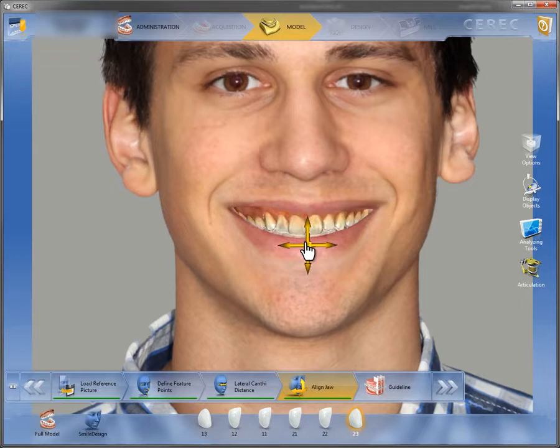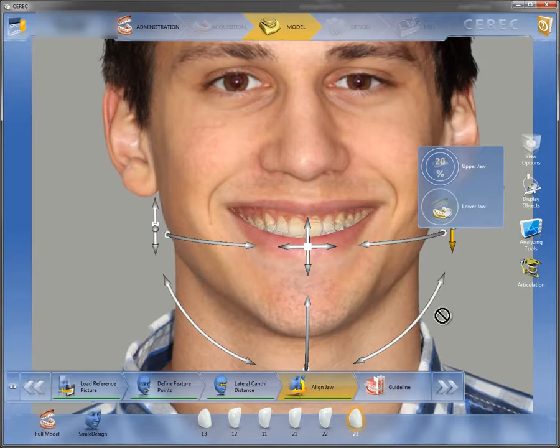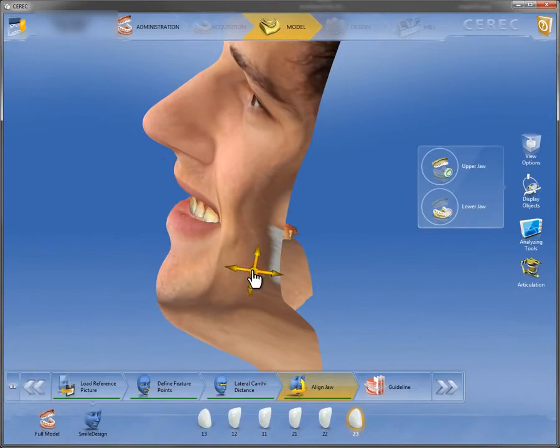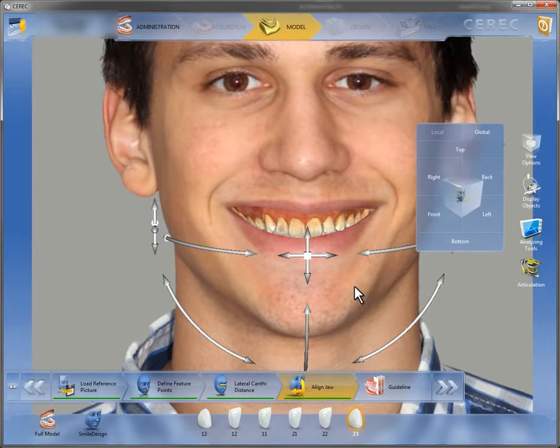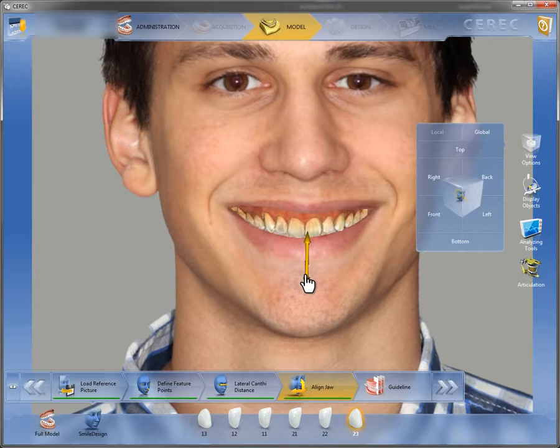The 3D model is then shown in the patient context and can be adjusted with the corresponding rotation and translation manipulators so that it covers the patient portrait exactly. As the patient portrait is a pseudo 3D model, it can also be checked from the side, from above, or below to fine tune the positioning of the 3D model.